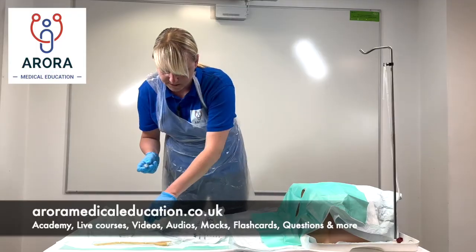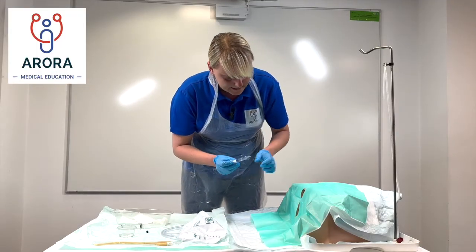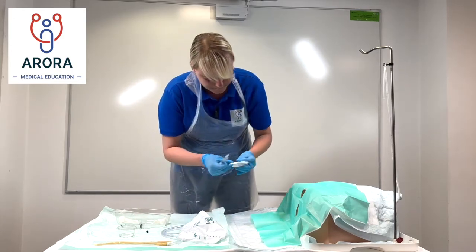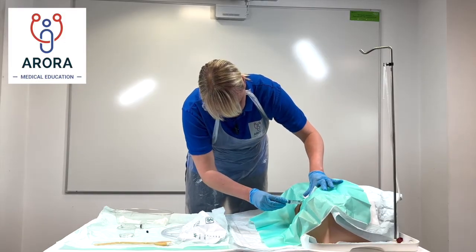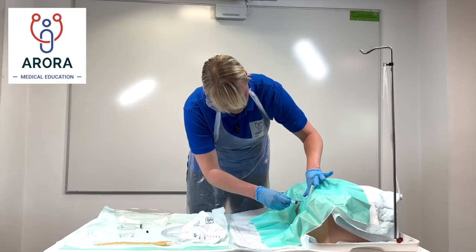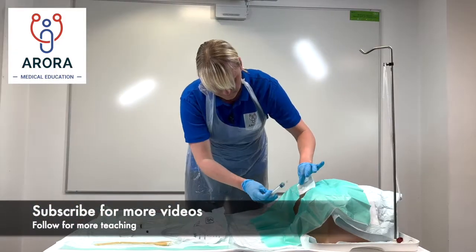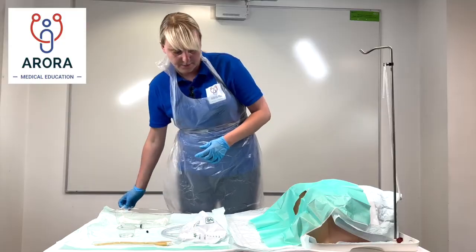'What I'm going to do first Mrs X is insert some cold jelly which will numb the area — sometimes it can sting a little bit as it goes in, so just let me know if it feels uncomfortable and we can stop. I'm just going to insert the syringe there now and you'll feel some cold jelly being inserted. There we go, I'll just give you a moment to let that work.'